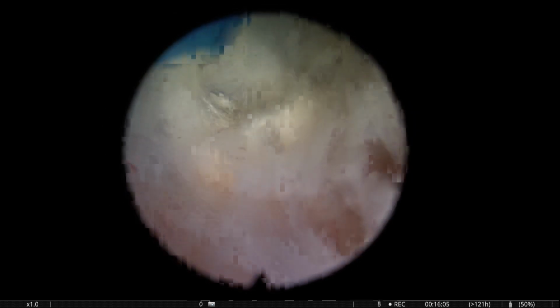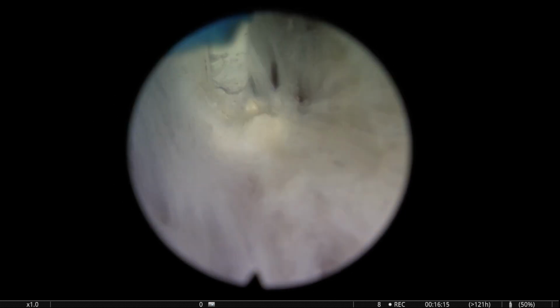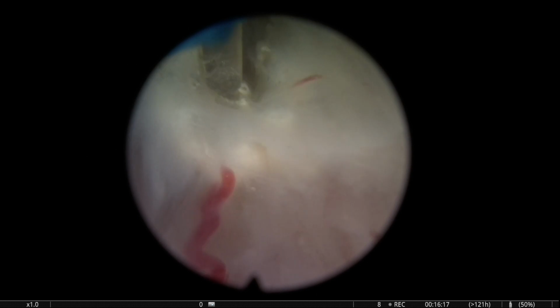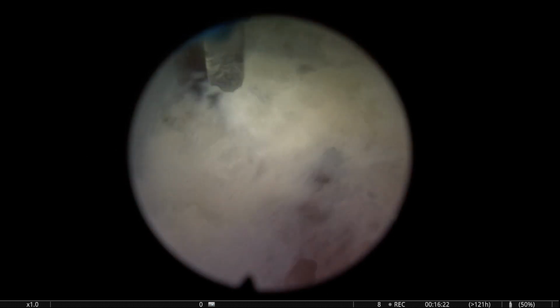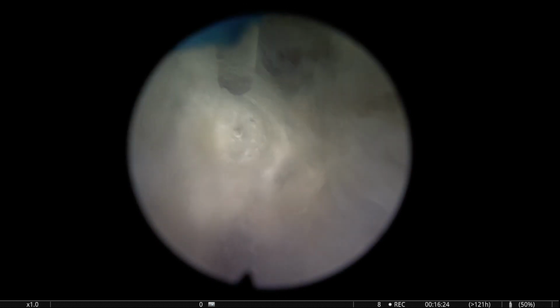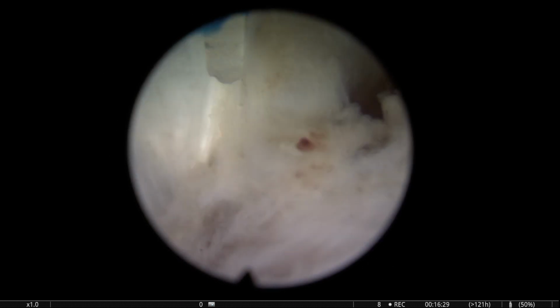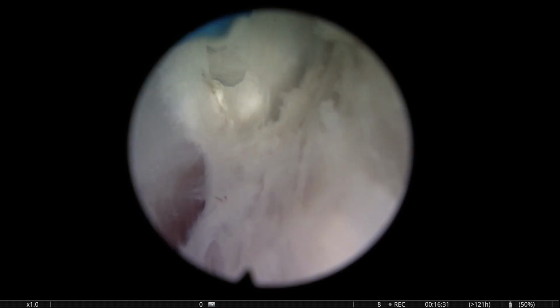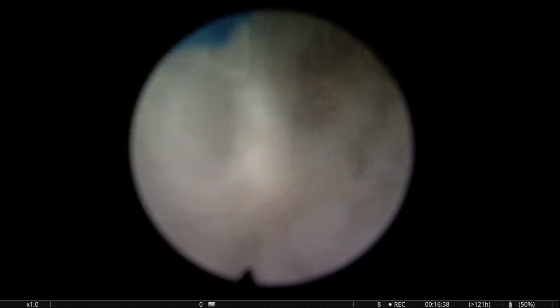But the truth is that often we follow a capsular plane that is maybe not exactly the best anatomical plane. And what I'm trying to say is that this is not the end of the world. We might be taking some of the peripheral zone with the adenoma in some areas, so we are deepening. But if you are not outside, if you're not perforating, it doesn't really matter that much. It's not going to compromise, I think, a good result postoperatively.